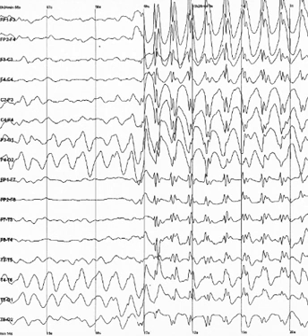Extremely non-invasive, unlike electrocorticography, which actually requires electrodes to be placed on the surface of the brain, EEG also has some characteristics that compare favorably with behavioral testing. EEG can detect covert processing, i.e., processing that does not require a response. EEG can be used in subjects who are incapable of making a motor response. Some ERP components can be detected even when the subject is not attending to the stimuli. Unlike other means of studying reaction time, ERPs can elucidate stages of processing rather than just the final end result.